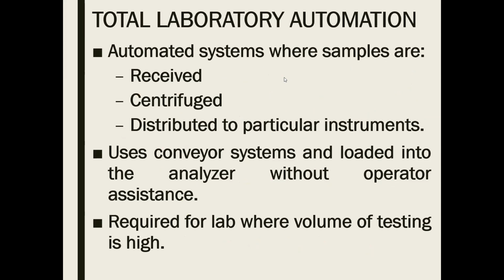And lastly, we have your total laboratory automation, no? Automated systems where samples are received, centrifuged, and distributed to a particular instrument. Sa Pilipinas, I am not sure if there are automated systems already. That is most probably in other countries. After centrifugation or after you receive the sample, you just load it in the machine, para siyang malaking room wherein yung sample mo may conveyor, no, from receiving to centrifugation, from centrifugation to analysis, and from analysis to result.